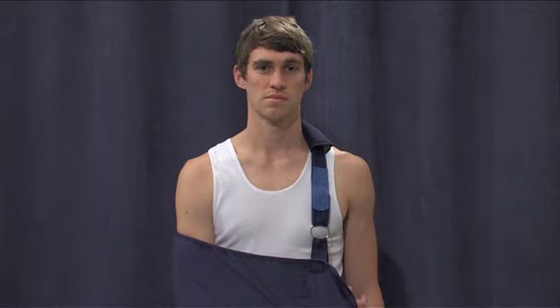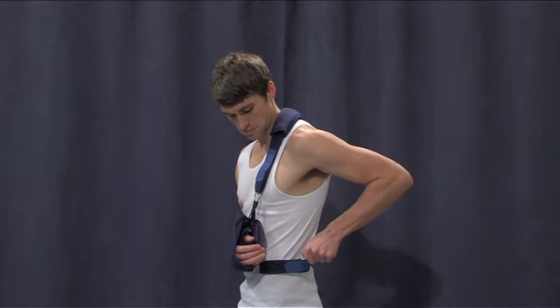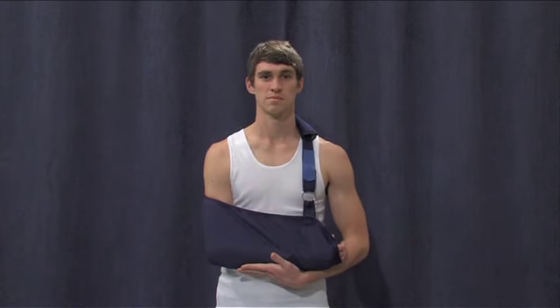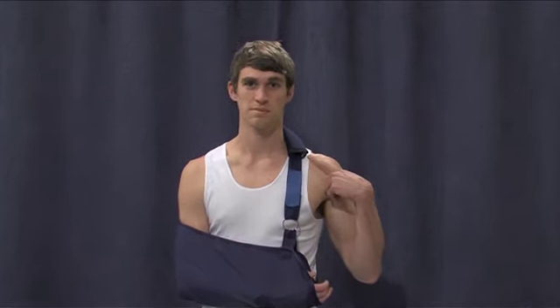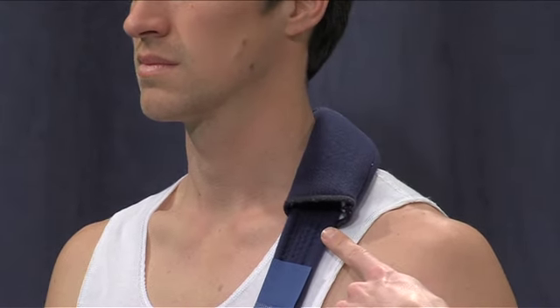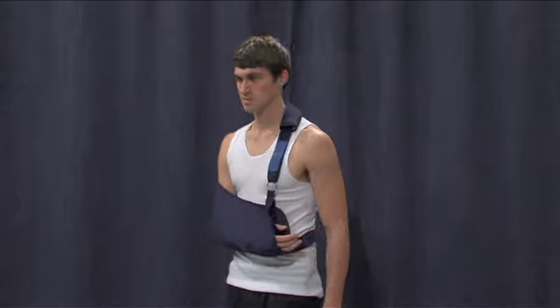The sling is made up of three parts: the shoulder strap, which points vertically up towards the head; the waist strap, which points around the body horizontally like a belt; and the sleeve, cuff, or pocket, which is what your forearm rests in. If you are not sure which strap is for the shoulder and which is for the waist, look for the extra padding found on one of them only. The shoulder strap has extra padding where it sits against your neck to make it more comfortable. This extra pad is not found on the waist strap.